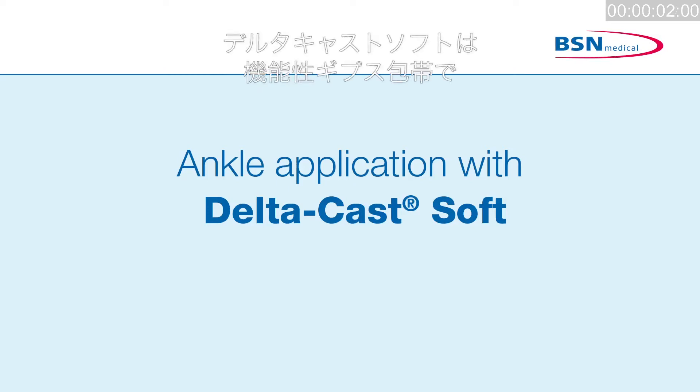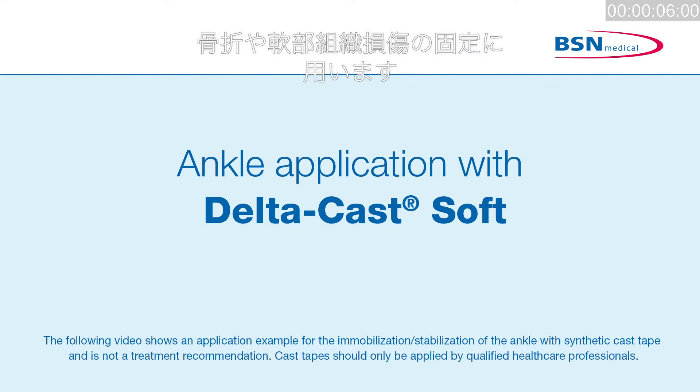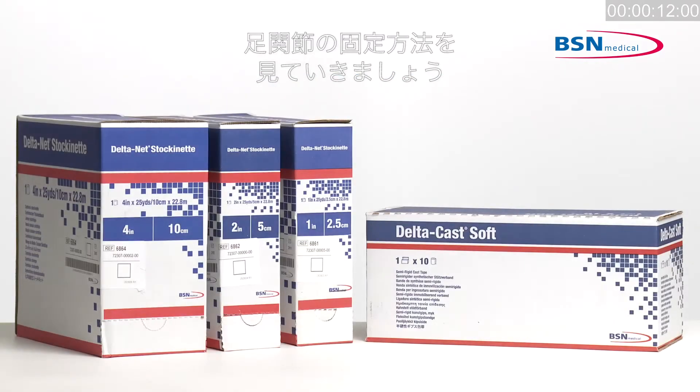Deltacast Soft is a semi-rigid polyester cast tape for the functional immobilization in the treatment of fractures and soft tissue injuries when limited movement is allowed, and for indications where stabilization of the ankle joint is required.